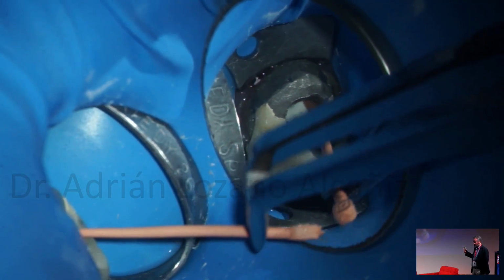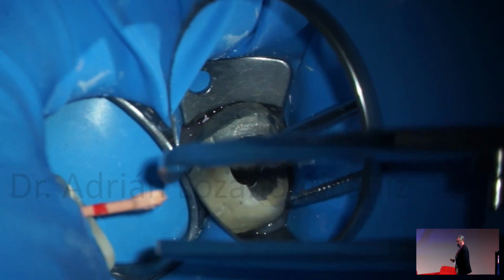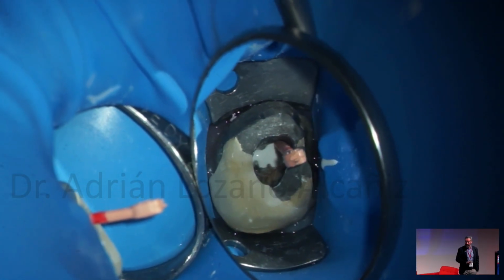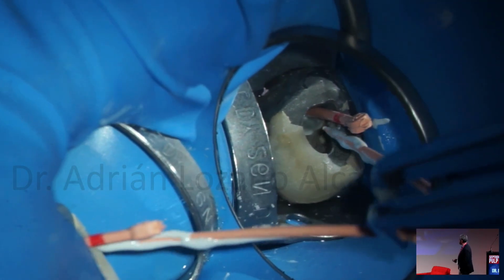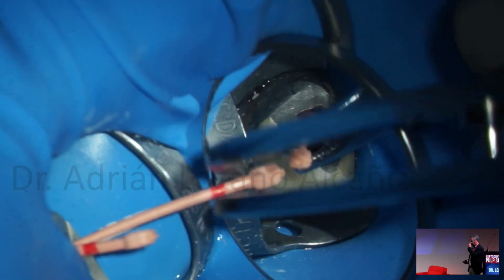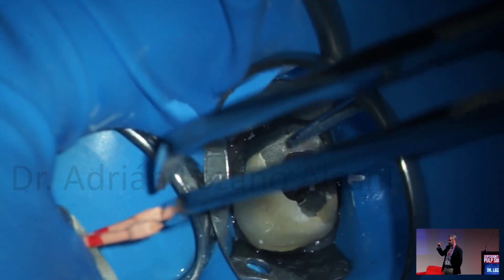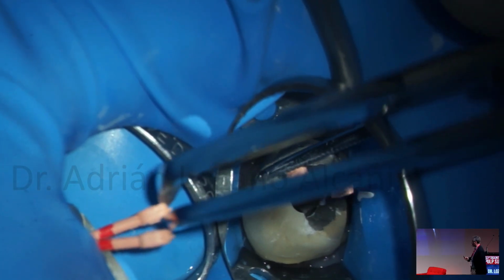Let me show you this case where the MB1 is going to be done with the warm technique and the MB2 with a cold technique. So here we have the MB1 and the MB2. At this point, it's a cold technique. We put the sealer with the syringe. We introduce the master cones.